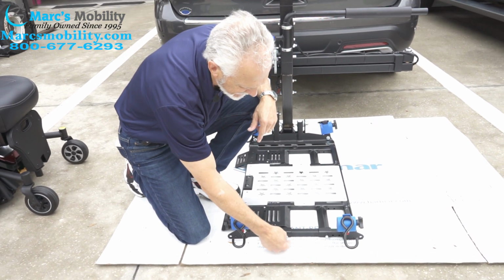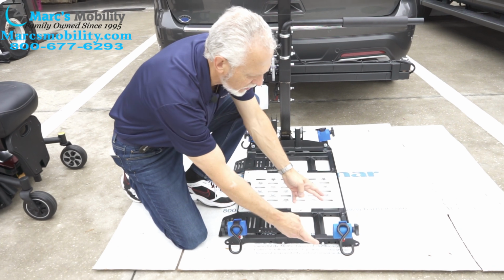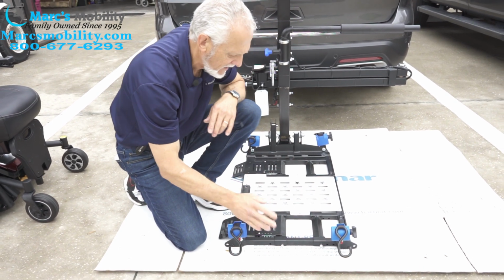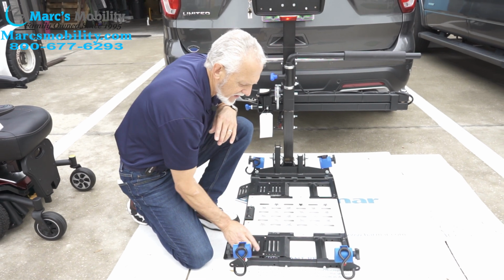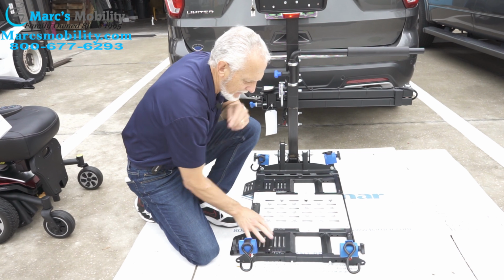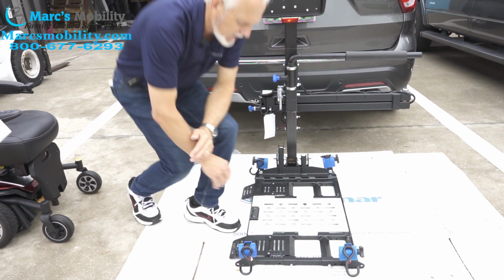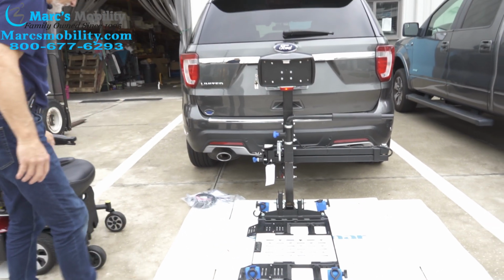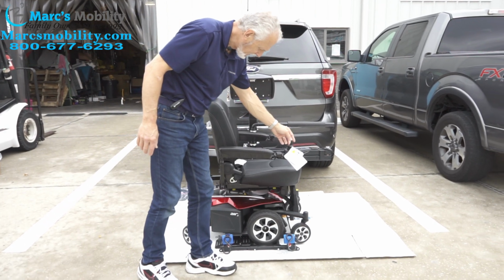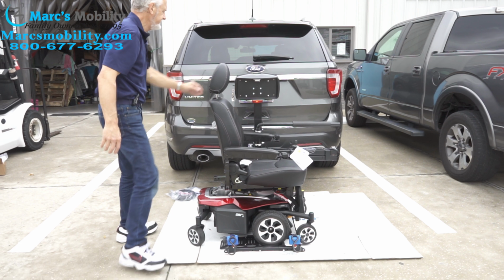You have 3 holes here. So you have to move this track forward and this track this way. So it all has to be in the last holes. And then you have to put your plate back on over here. There's a little plate with 2 screws with these grooves that you have to put back on top, okay? So if you're gonna put a smaller chair, like this one here, it'll go right into the tracks.